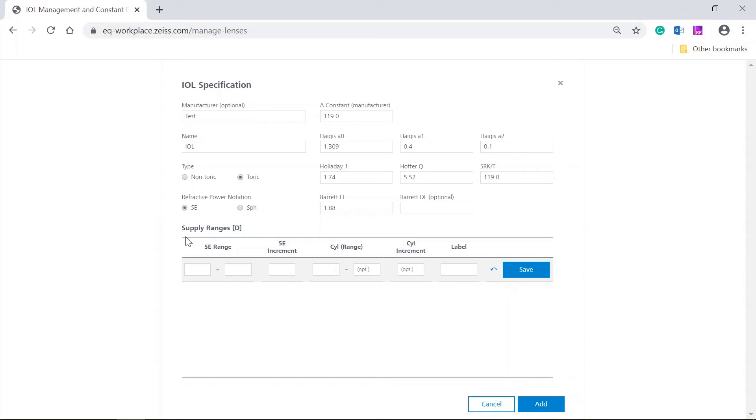Now enter the SE range for the first delivery range, for example, plus 6 to plus 32. Enter the SE increment accordingly, for example, plus 0.5 diopters.